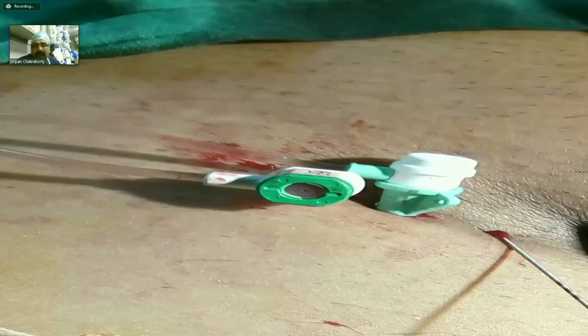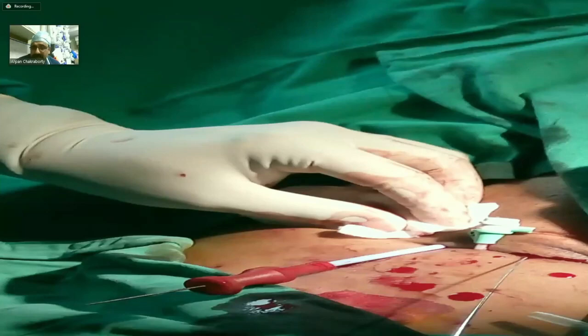In the picture we have seen the way we do it in the patient. You can see from the right side of the screen a guide wire which is going, which is the venous guide wire, and you have two sheaths present in the same femoral artery. One is going towards the head and one is going towards the leg, and you just serially dilate the sheath which is going towards the head end, and you start the ECMO as soon as possible. This is the way we get the cannula in and serially dilate. The way we do it, it should be a bit faster at that point of time.